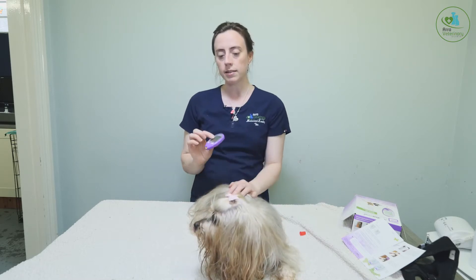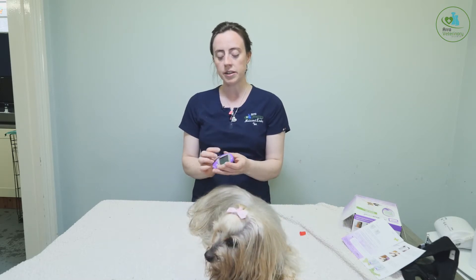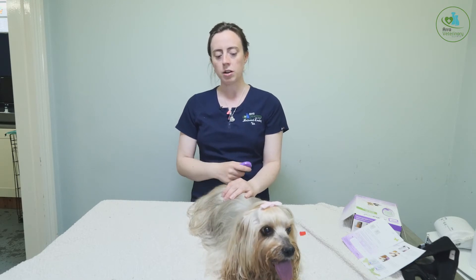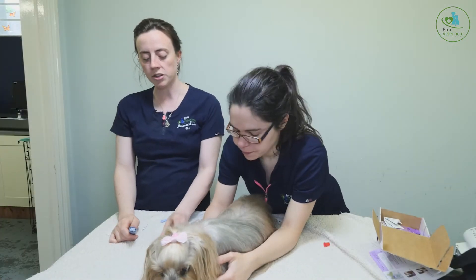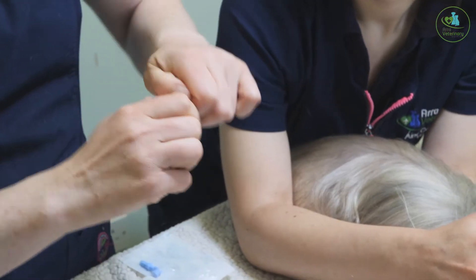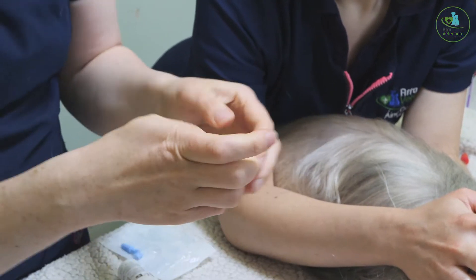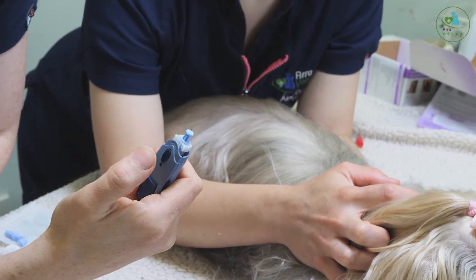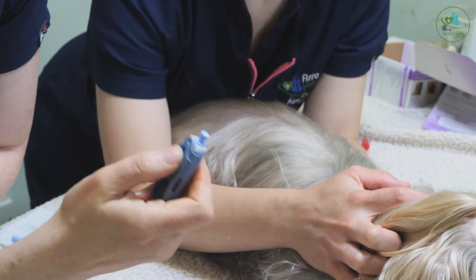Taking a blood glucose is really simple — something owners can do themselves to monitor their dog's blood glucose. In a blood glucose monitoring kit you get your monitor and a lancet. You twist it, and the lancet has a tiny little needle on the top. When you press the button it gives a little prick, which punctures the capillary area so you can take a small sample.